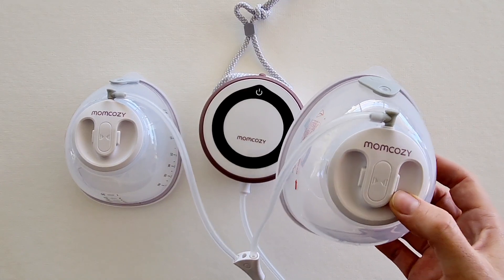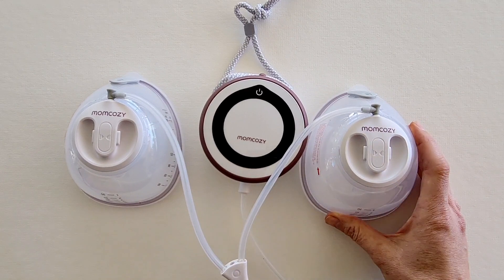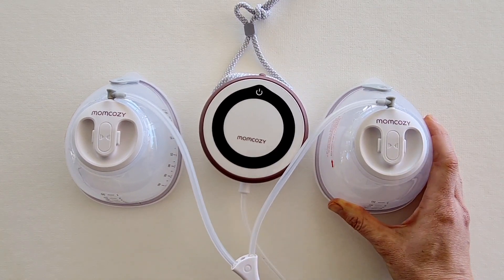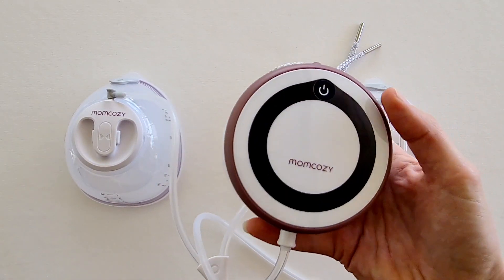The battery life on the V1 also lasts for 150 minutes — that's up to seven pumping sessions — which I feel for a wearable breast pump is really quite good.